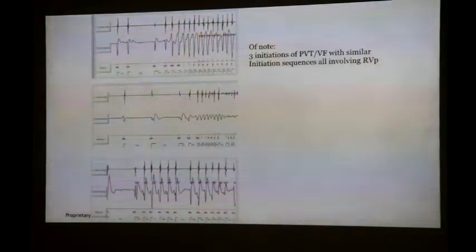Anyway, the first step is, when you see any episode, look and see: did pacing start it? It's not uncommon, and it's called PITS, P-I-T-S, pacing-induced tachycardias. It's really not uncommon. It's quite common, okay? And the fix is normally just stop pacing, and if they don't need pacing, turn it off.